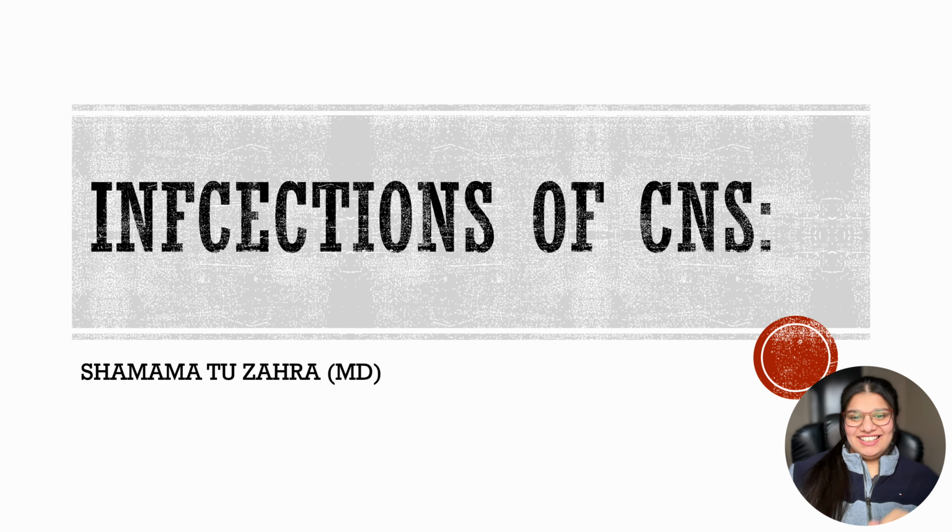Hello everyone, this is Dr. Shamama, and today our topic of discussion would be infections of the central nervous system. This is a very interesting topic, and it's very fascinating for pathologists when we see infections and organisms under the microscope. So this is going to be a lot of fun. So let's start.